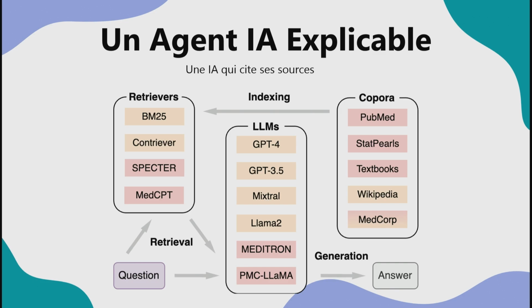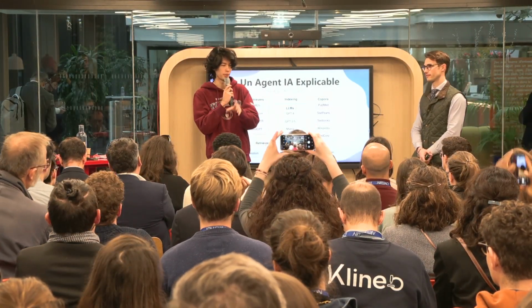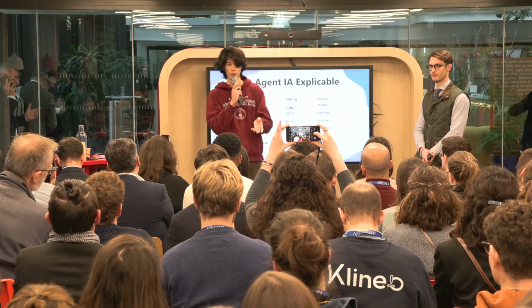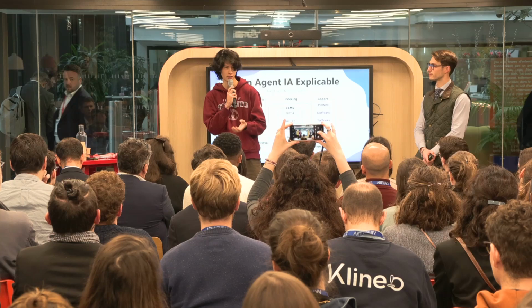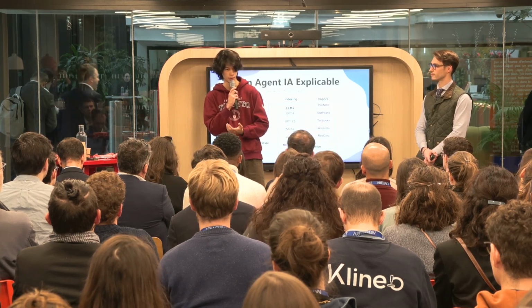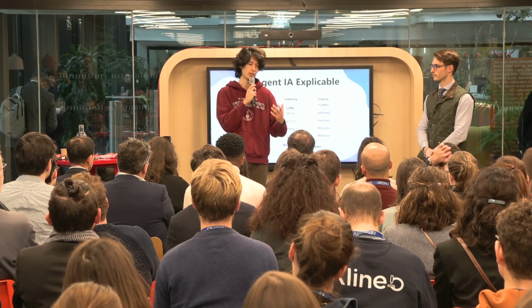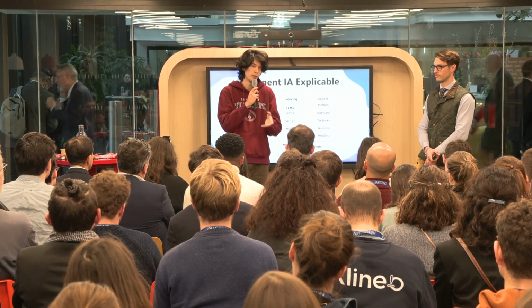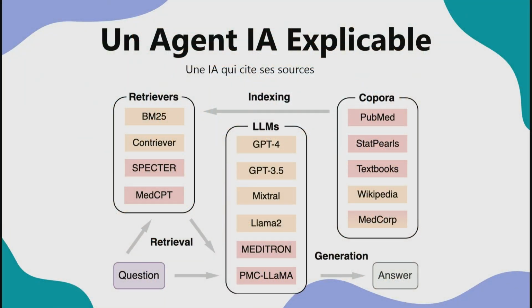So what we want to do with the AI, and this is the rough framework of an agentic system that uses RAG, is you give it the images, you give it the data of the patient history, and you give it the radiologist report, and it has a bunch of tasks it can do. The big one that we're really interested in targeting is detecting diagnostic errors. There's established research that shows that even just ChatGPT without an augmented retrieval system can already retrieve a bunch of diagnostic errors and then flag them and increase the throughput of the doctors.